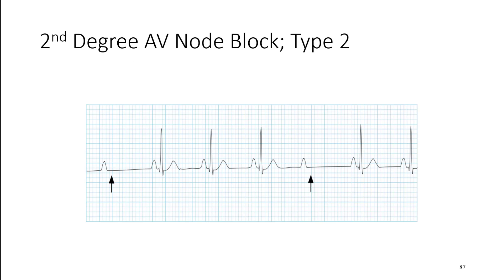A second-degree AV node block Type 2 is a little bit more concerning than Wenckebach. Both are concerning, but this is more so. This occurs when there is no precipitating prolongation — though these patients often still have borderline prolonged PR intervals. In this example it's actually a little bit normal.